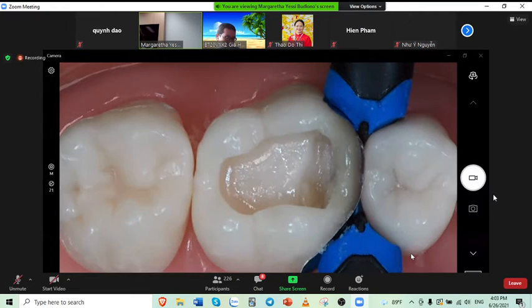Okay, then this one I feel it's good. And I will light cure it first.